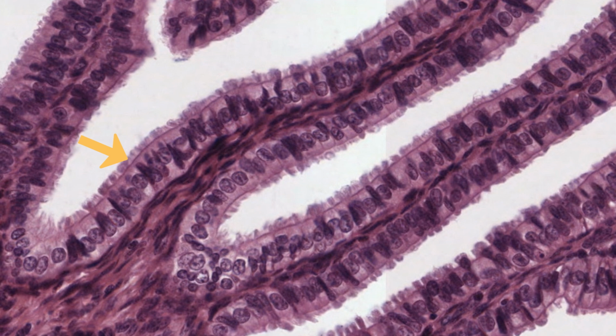These cilia help move the oocyte along the uterine tube towards the uterus. The peg cells are secretory cells producing fluid, providing nutrients to the ovum as it passes along the passageway.